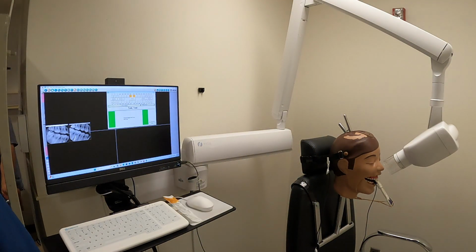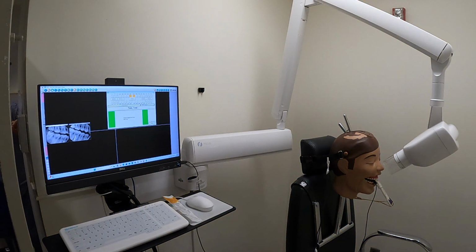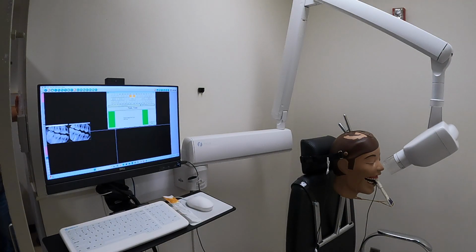Okay. And then we are taking an upper, it's on digital, 70 kVp, it's on adult. Okay, let's go ahead and take that picture.